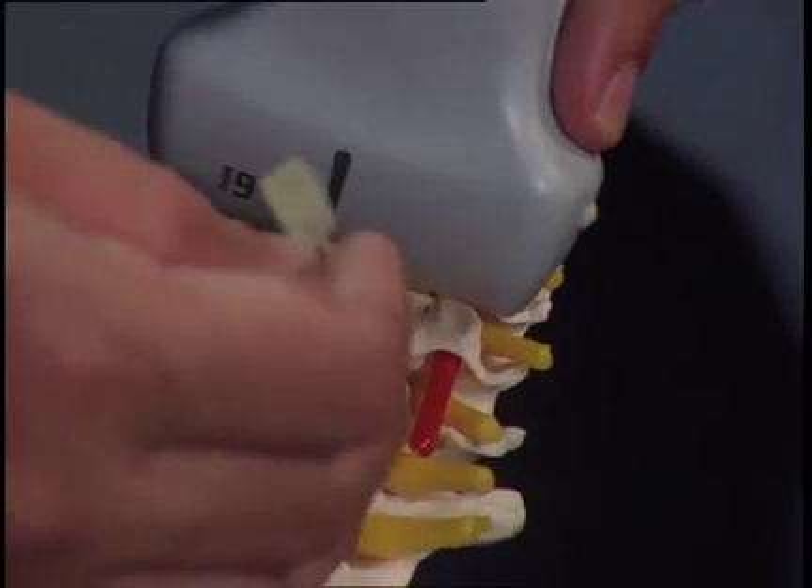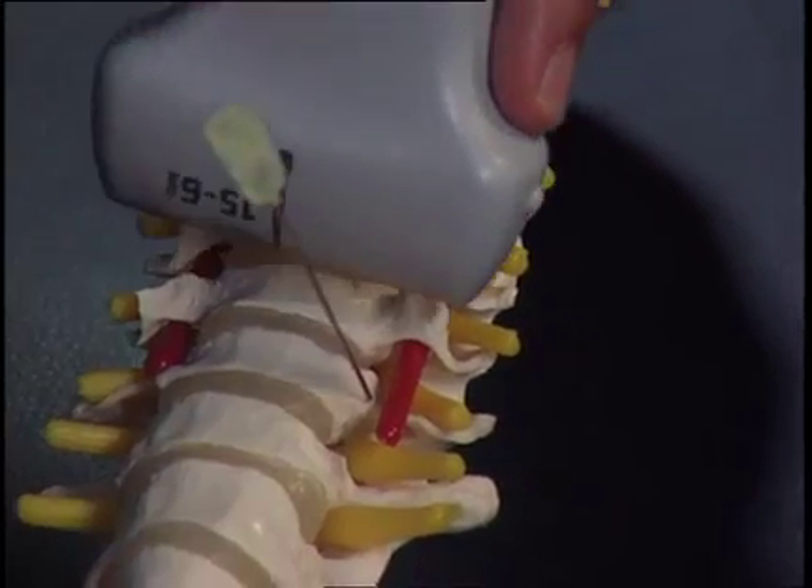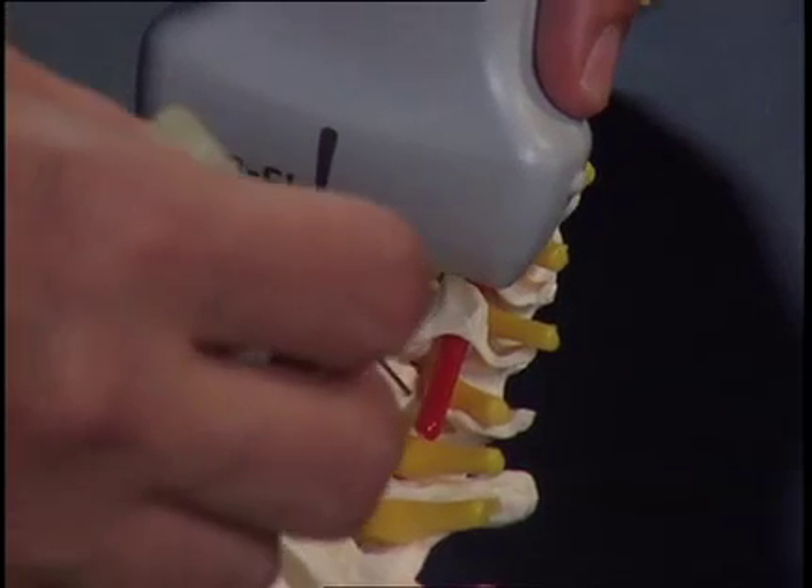The probe is placed in the transverse orientation, clearly identifying and avoiding the vertebral artery and the needle coming in contact with the C7 transverse process.